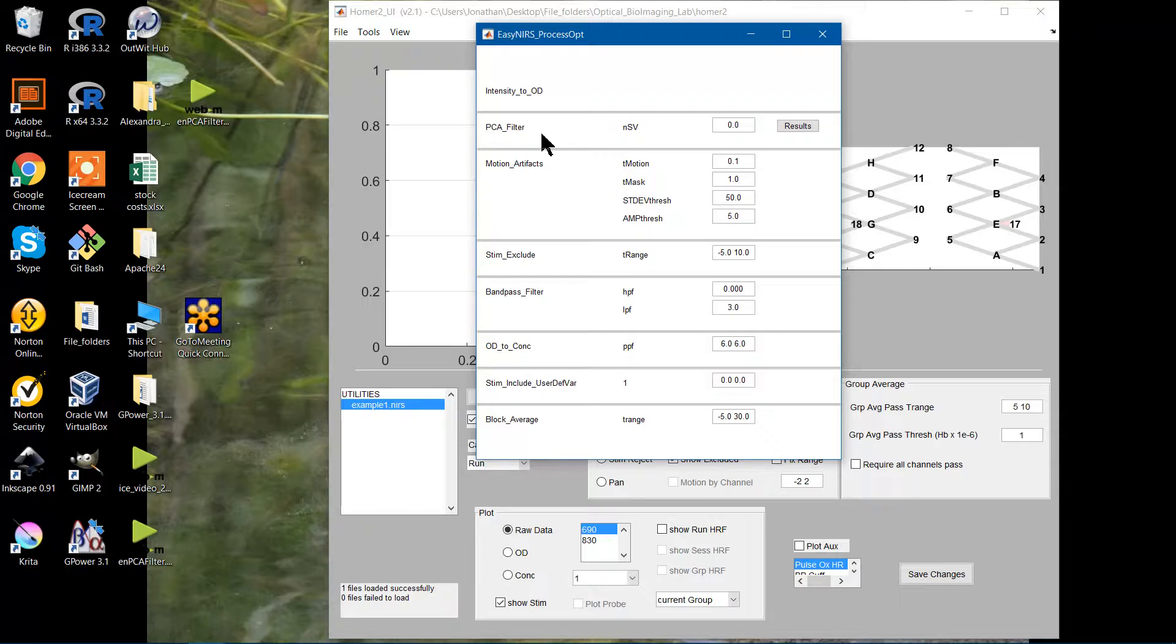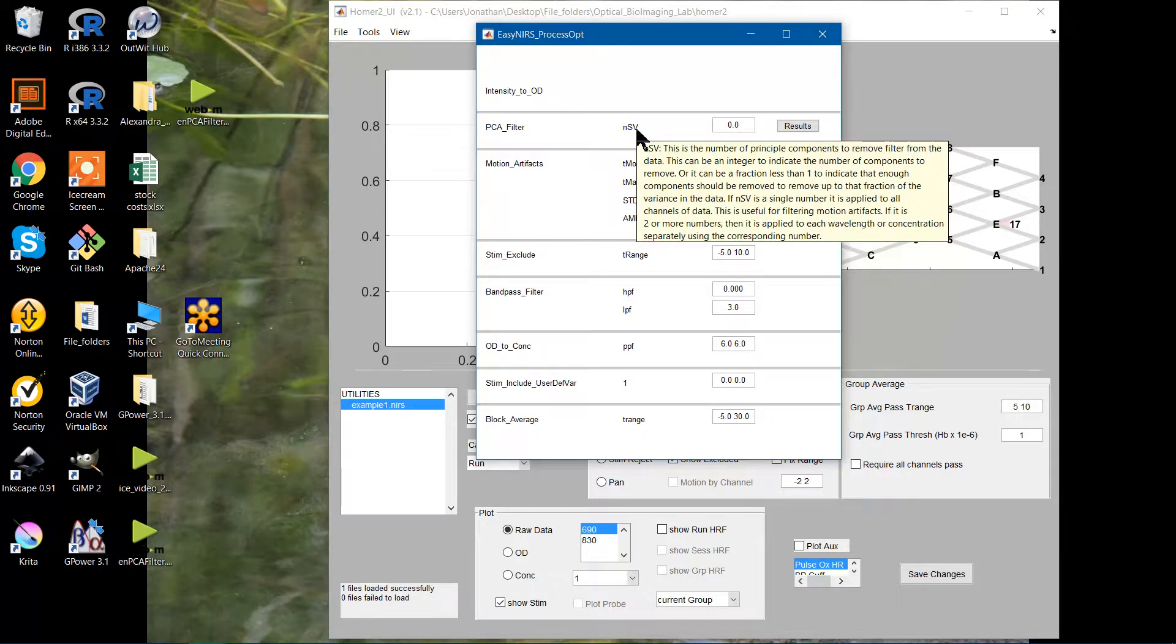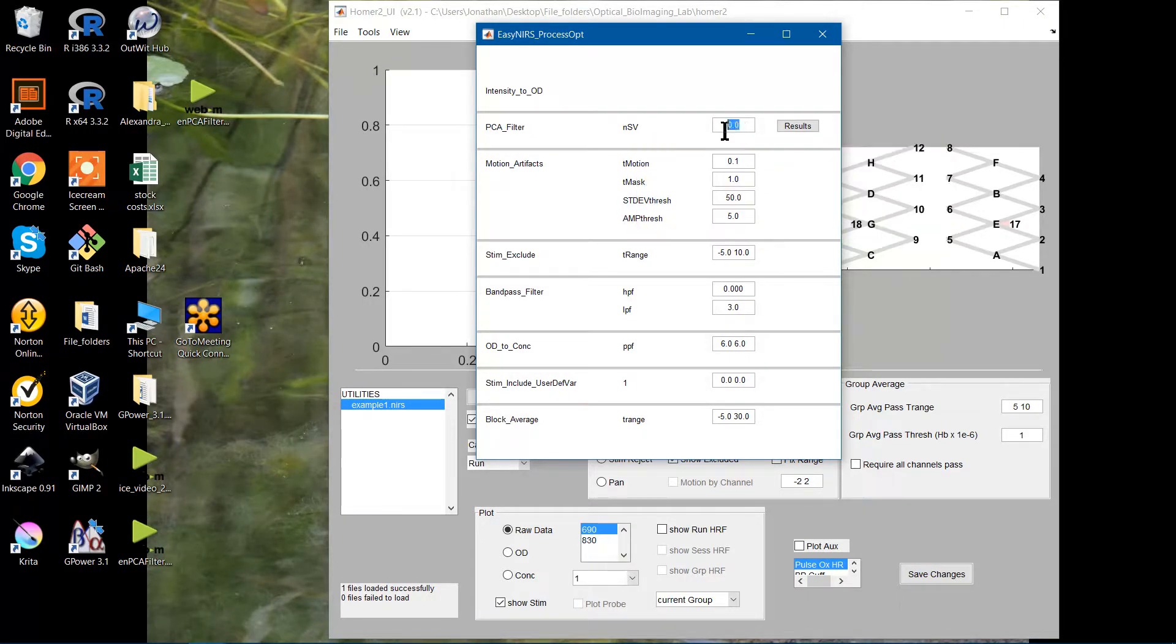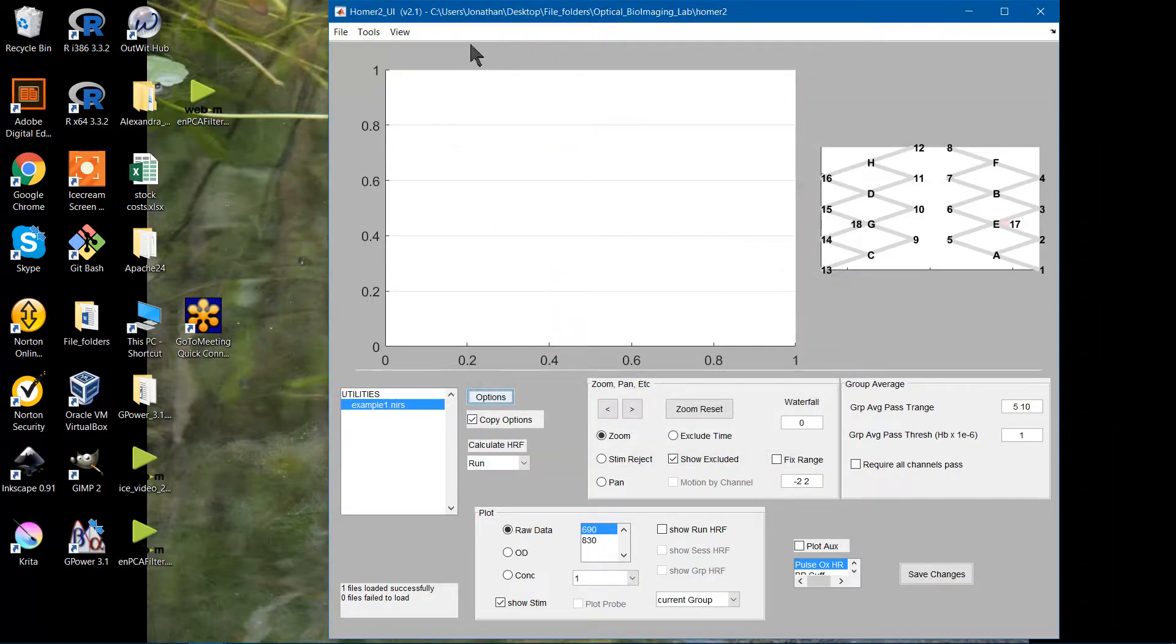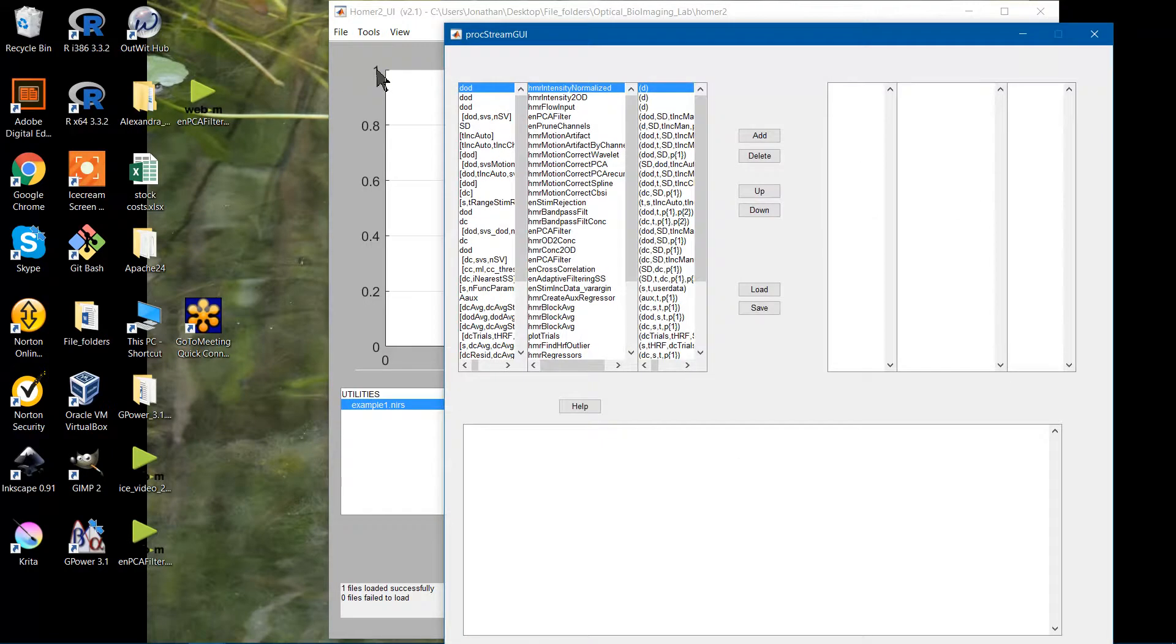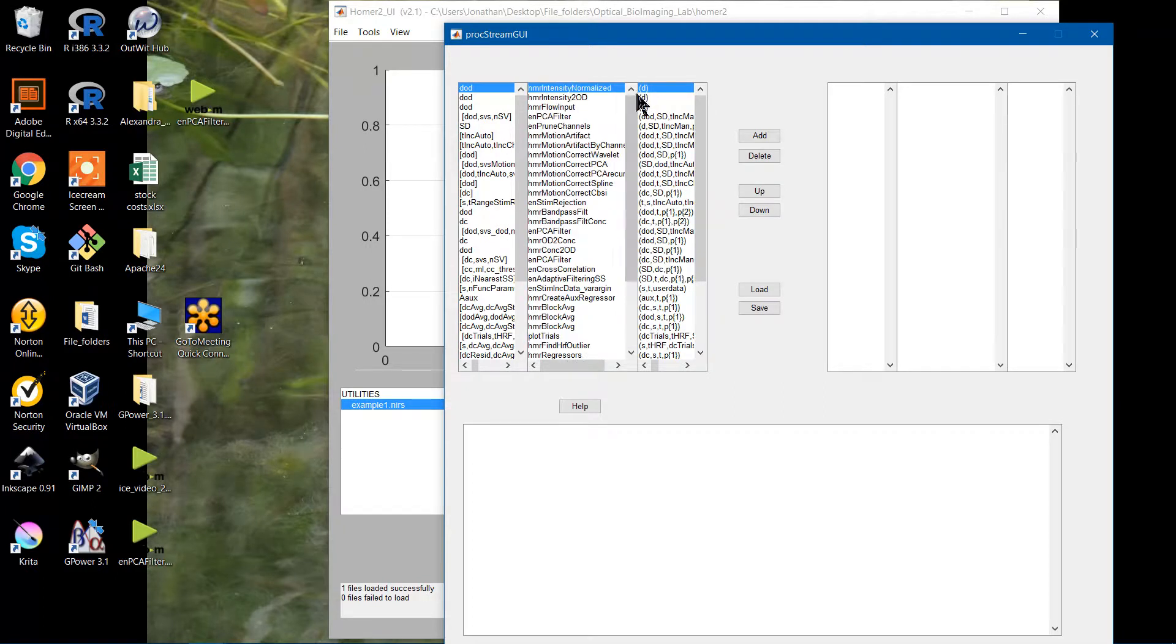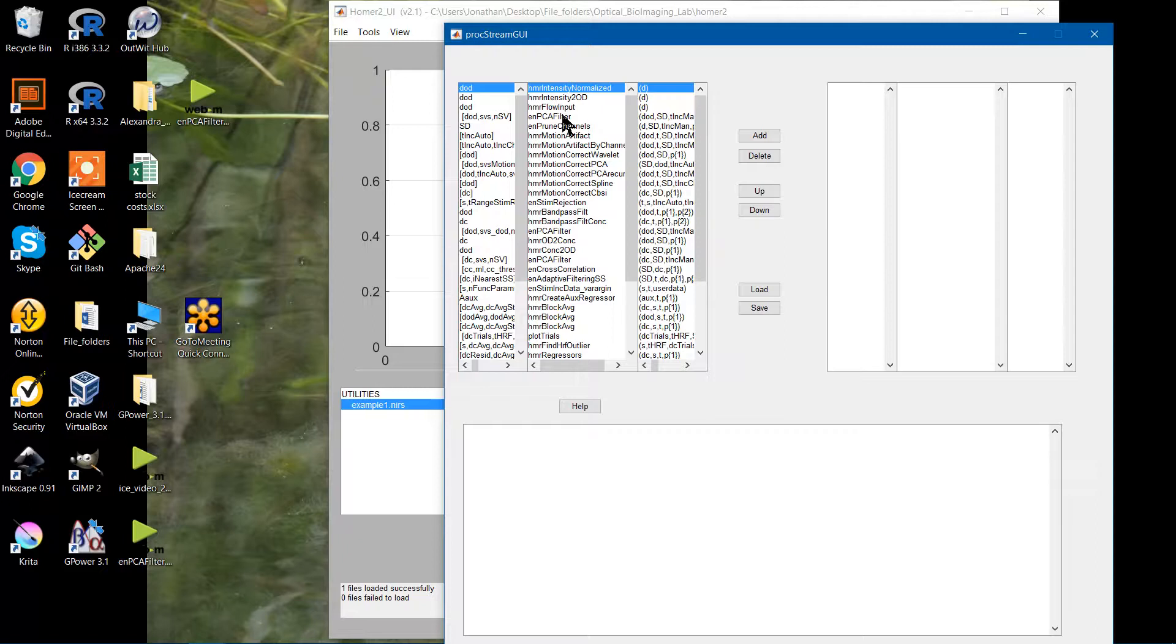If you want just a general bit of info about it, you just hover your mouse over the variable here for a little more depth. Here's where you're going to actually input your variable. So if you want a slightly more in-depth view, go to tools and processing stream GUI. This is where you have all the possible options to add and maneuver around in your custom processing stream.